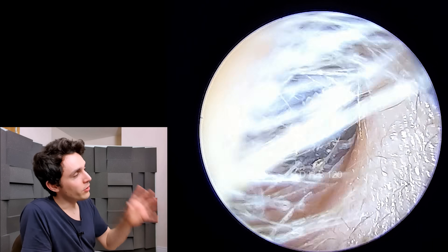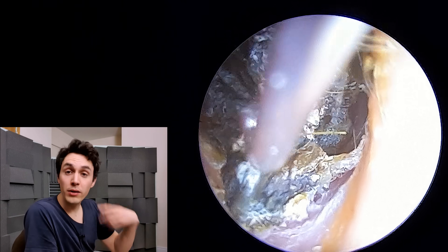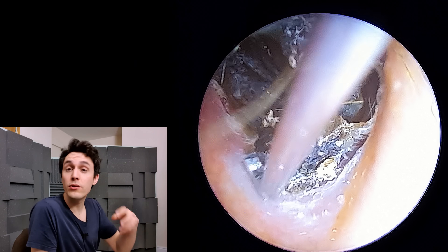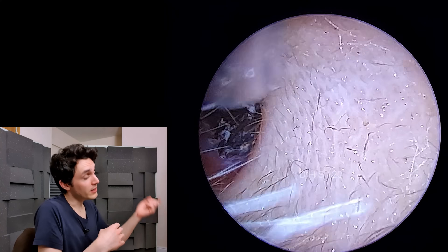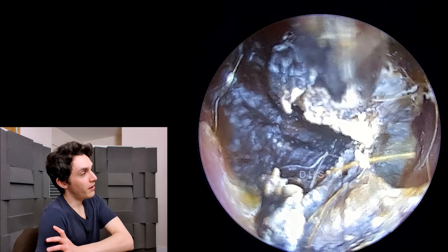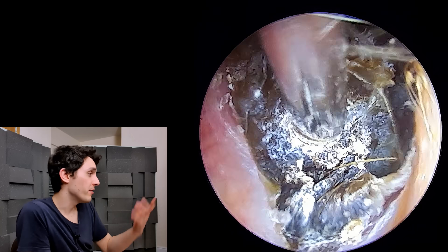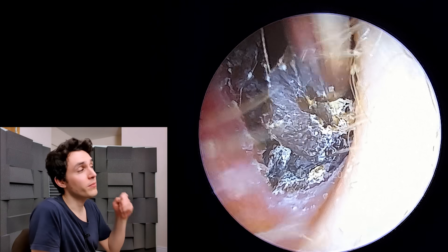However, the patient's doctor has specifically asked me to remove this debris. The case history is that a couple of weeks ago the patient had blood coming out of their ear — minimal pain, but there was blood — and the patient panicked and ran to see their doctor. The doctor, suspecting a perforation, looked in the ear and couldn't see anything. They've sent the patient to me so I can remove this debris and then we can confirm whether or not the eardrum is damaged.